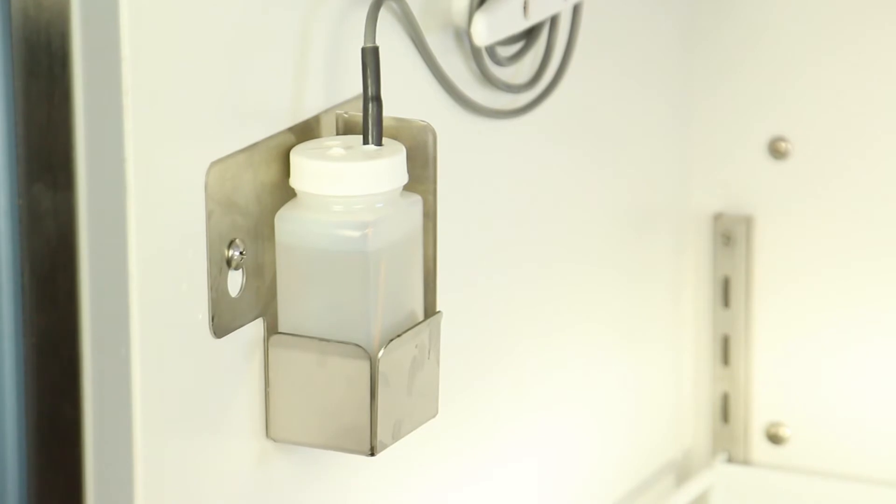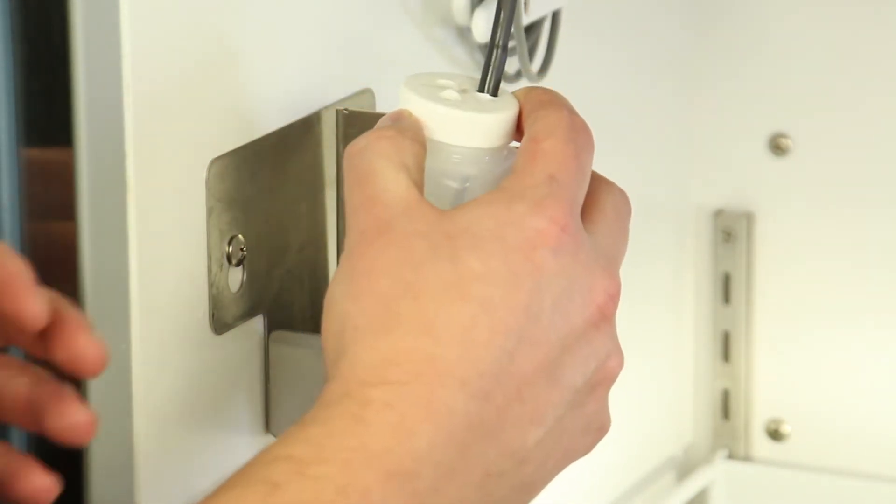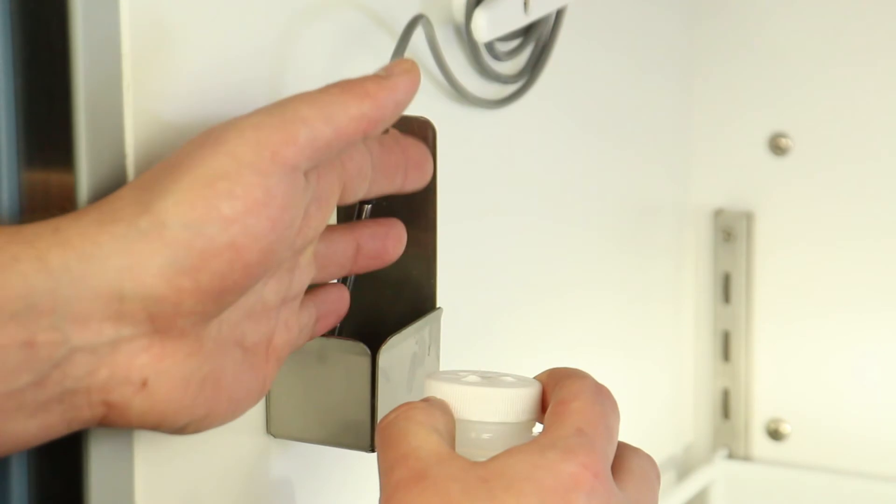First, remove the primary monitor probe from the upper probe bottle. Then unscrew the cap from the bottle.